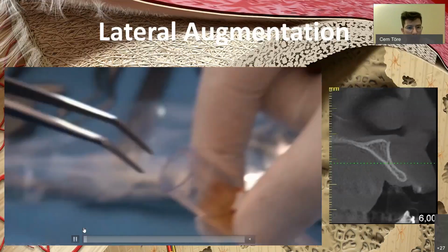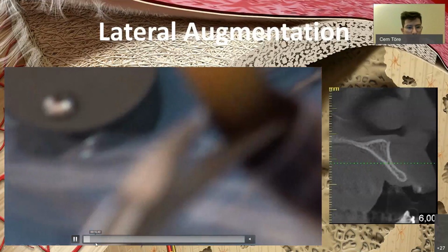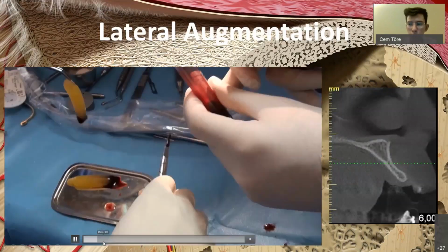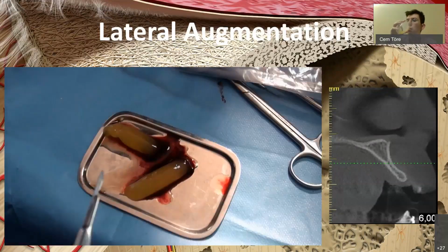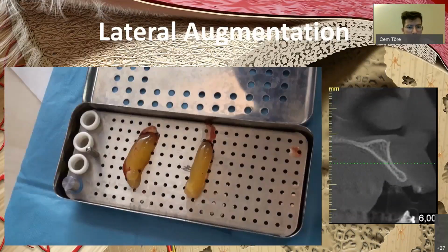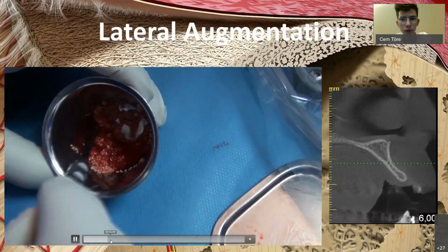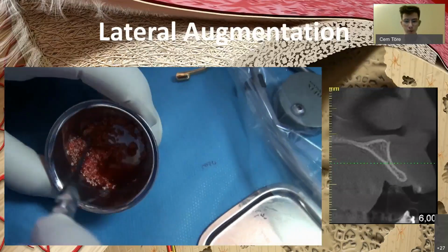We take some venous blood, we make some PRF membranes for soft tissue healing. We press on them with the weighted plate, like we mentioned. Create the membranes. We mix the bone. We have shaved autogenous bone.